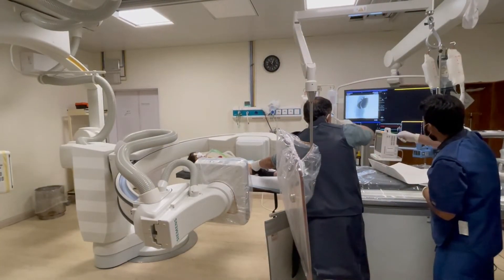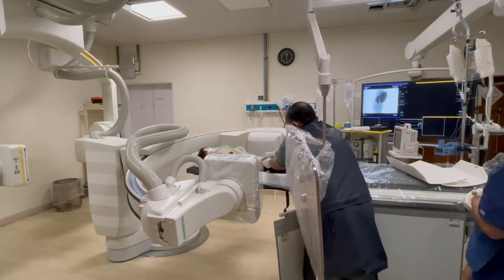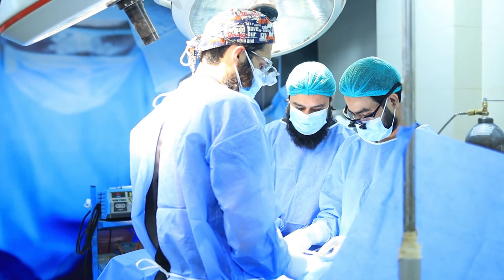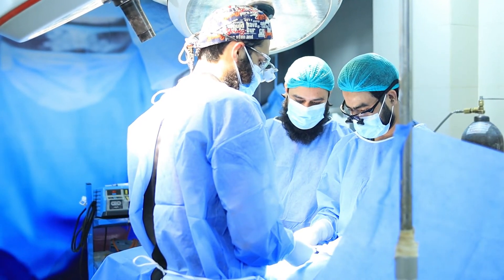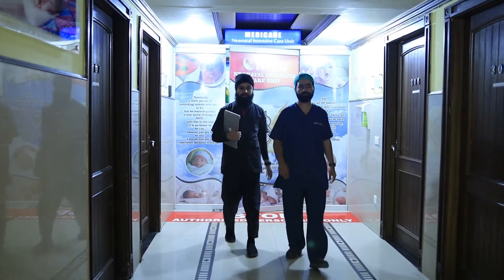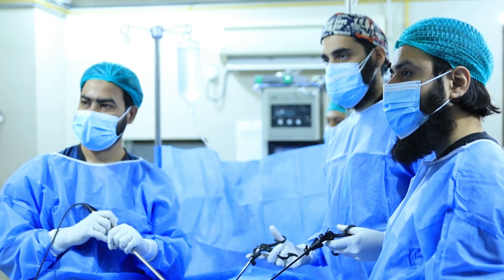This 3D cloacal gram has shown its superiority over conventional methods and it is really more accurate than other methods. These complicated patients require a highly specialized team which must be working in collaboration with each other. Luckily, at our center, we have all the required specialists including pediatric surgeons, pediatric urologists, anesthetists, psychologists, radiologists and nutritionists. We are the first ones in Pakistan who started performing this study with the aim of providing standardized health care to our patients.